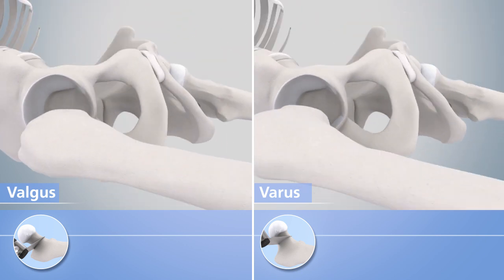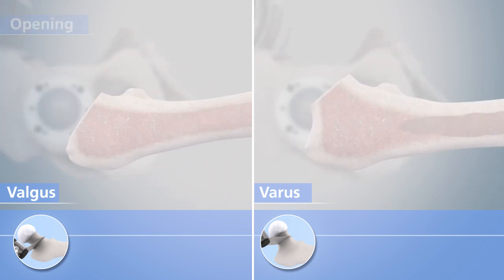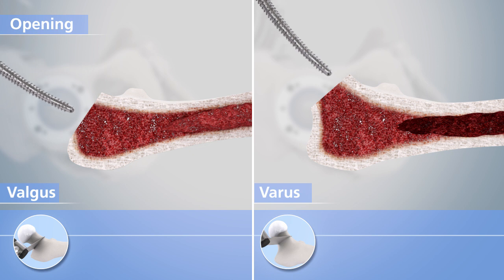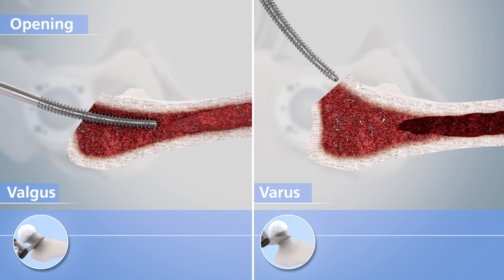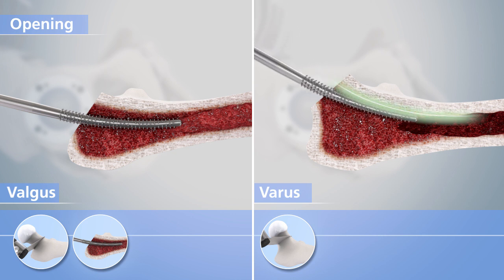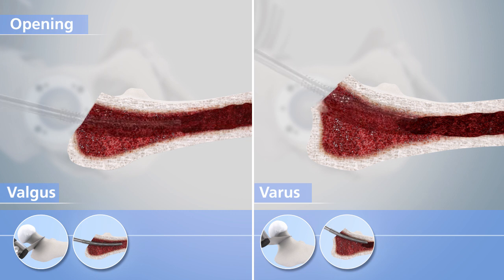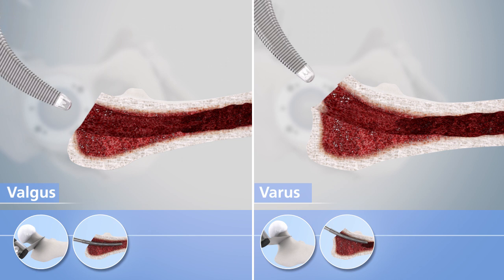After removal of the femoral head, preparation of the acetabulum and insertion of the acetabular implant, preparation of the proximal femur begins with the curved opening broach. The entry point of the opening varies depending on the planned stem positioning. If a valgus position of the short stem is desired, the entry point into the femur is to be located in the middle of the resection plane and along the femoral stem axis. If varus positioning of the implant is to be achieved, the entry point must be selected strictly in the area of the medial cortex and along the calcar, protecting both the lateral cortex and the lateral cancellous bone in the region of the piriform fossa.